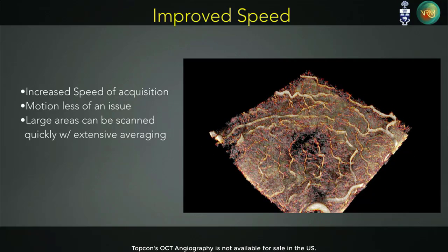Now, obviously for presentation purposes, it looks nice. How do we use this information? Can we start calculating volume of edema instead of just area, and macular thickness concepts begin to change? As we start to explore the information we can get out of these machines, our applications will also start to change.